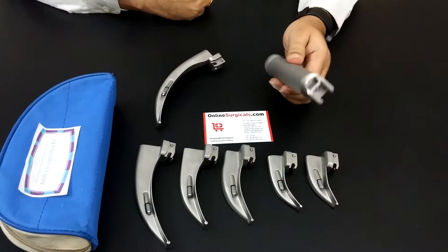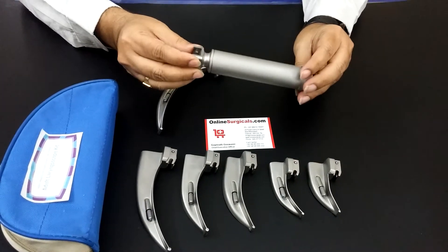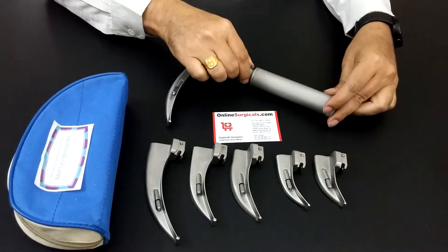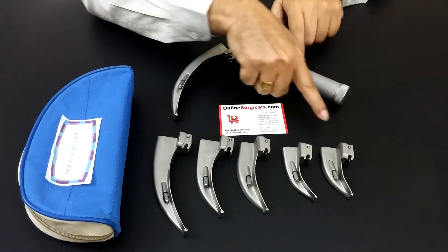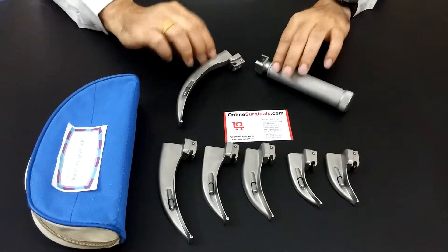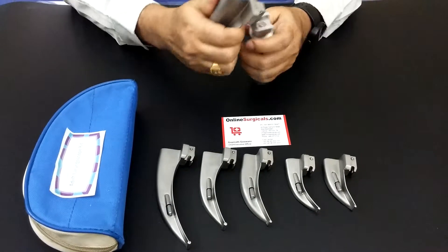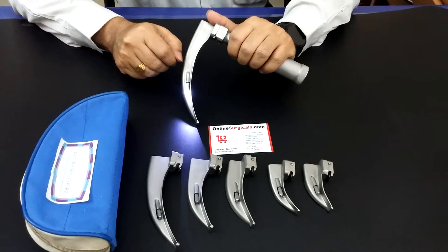This is a laryngoscope with stainless steel with matte finish. It is supplied with all sizes of Macintosh blades: size 00, 0, 1, 2, 3, and 4. They are all supplied with white LED bulb with very bright lighting.